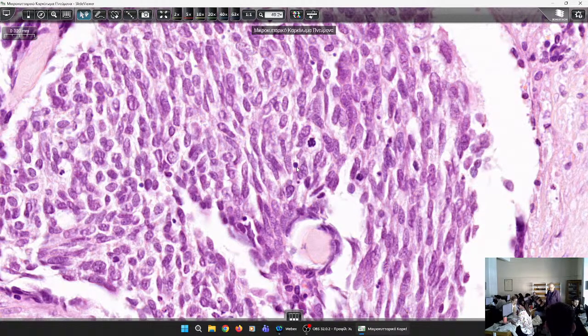What can this be? And which is the relative biological procedure which can be targeted by chemotherapeutic drugs that induce this mechanism that is already apparent in the malignant cells and makes them fragmented like this. Which is this? It's the apoptosis.